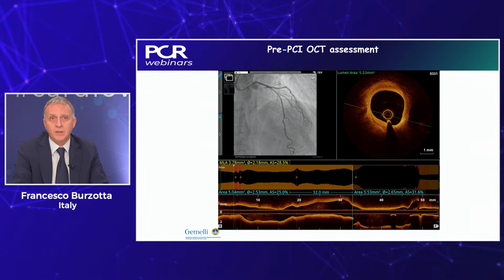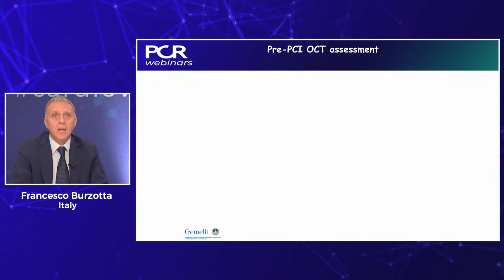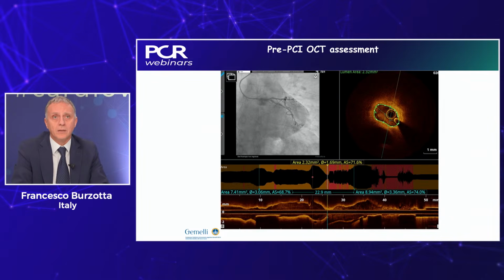On the opposite, there is some plaque in the distal left main. You may see it here. And in the other pullback, over the circumflex, we really confirmed this tight lesion at the ostium of the circumflex, and also the irregularity in the lumen induced in the left main by the plaque.